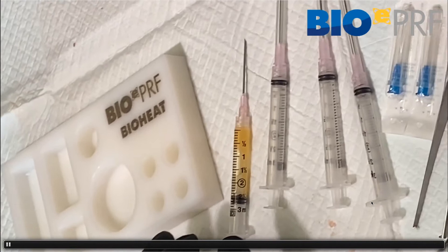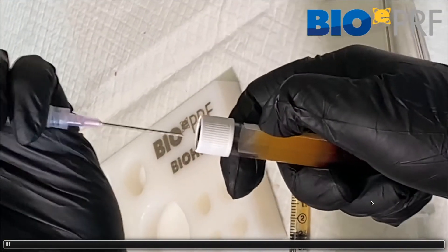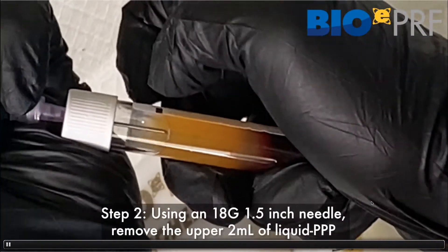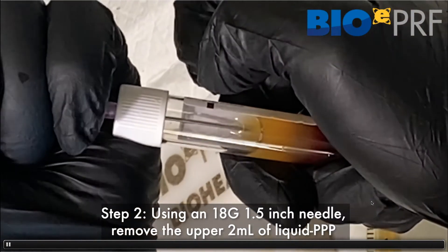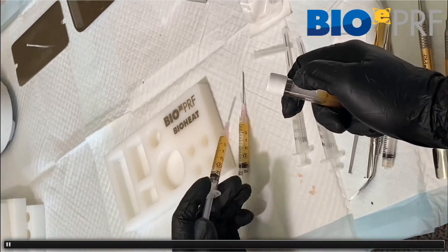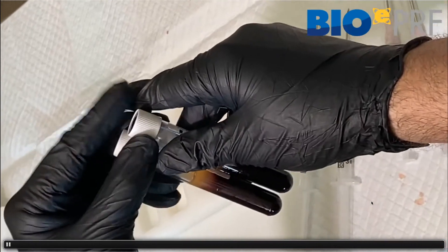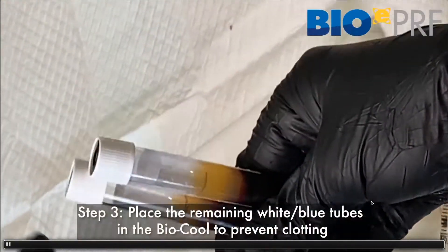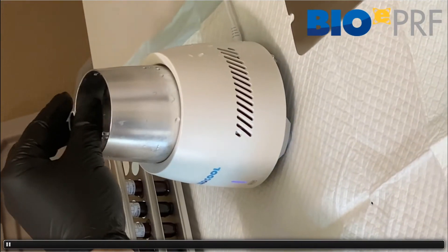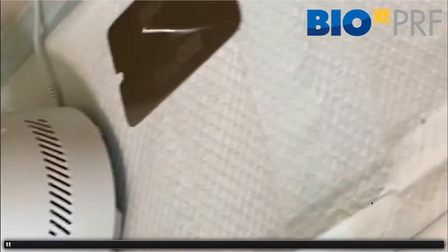You're going to draw out that liquid PRF in the exact same way — the upper layer, the PPP layer, the liquid platelet-poor layer. That upper layer doesn't have as many cells as the bottom portion, closer to the CPRF layer. When that's drawn out, we're going to take our blue caps and place them on the syringes. At the same time, we have to make sure that those go into the biocool — that's going to extend the working properties of the liquid PRF.